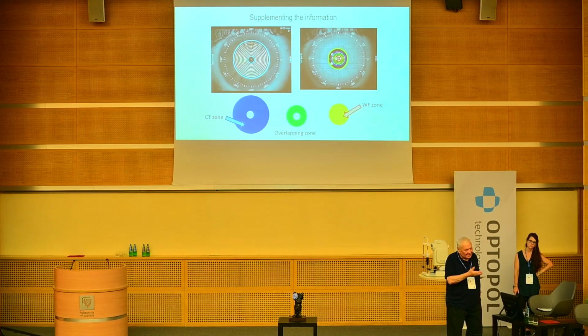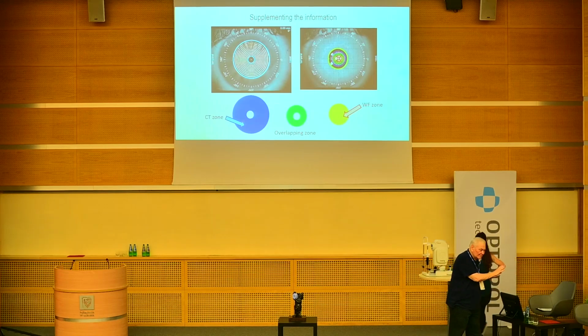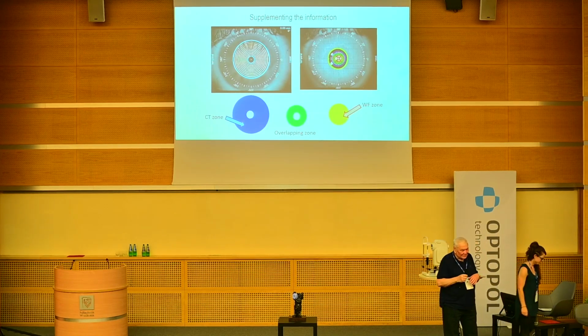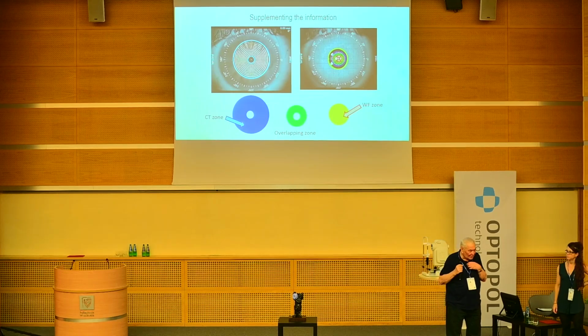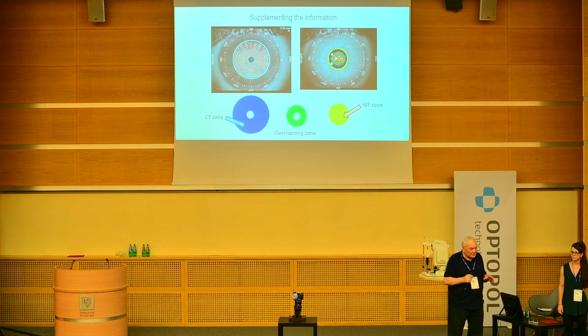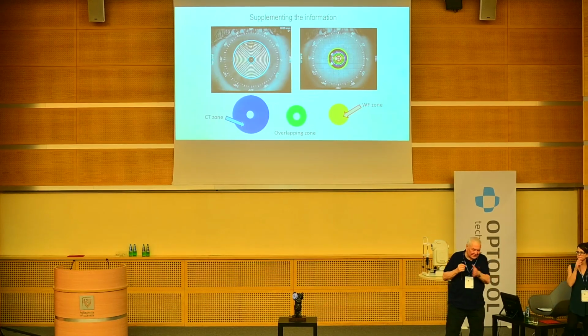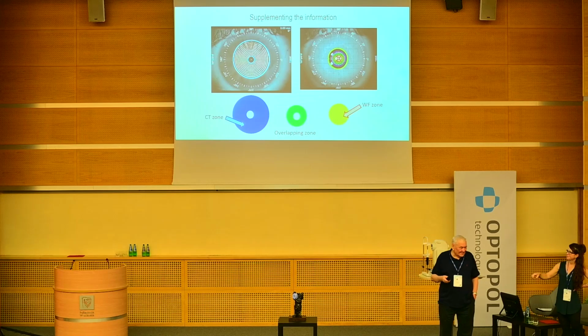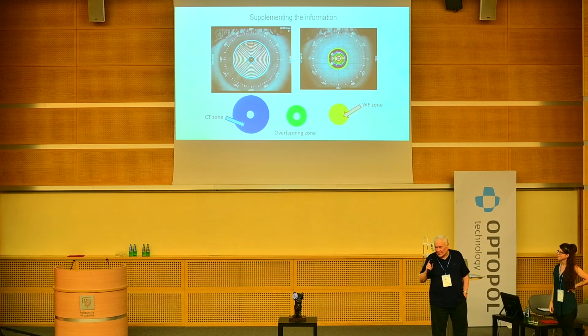I asked our medical employee to do it at least separately. For now, we can do it simultaneously. So we make it and have the sequence of placido and the sequence of refraction. And so covered, in the future. Okay, thank you.